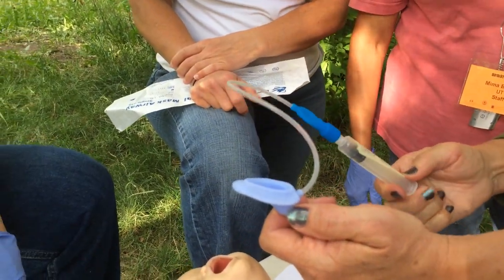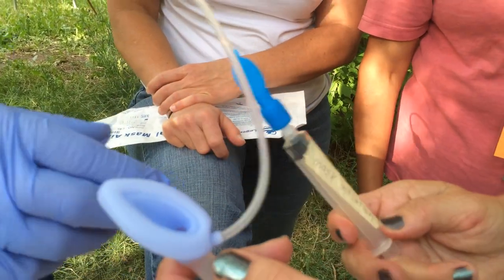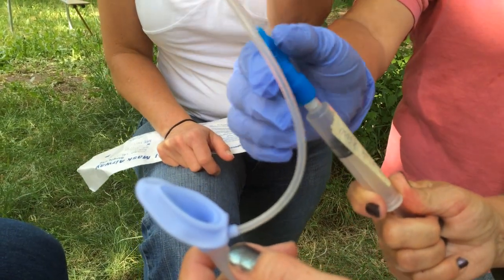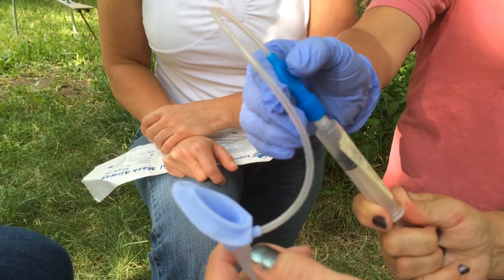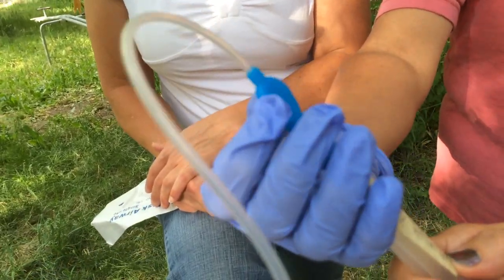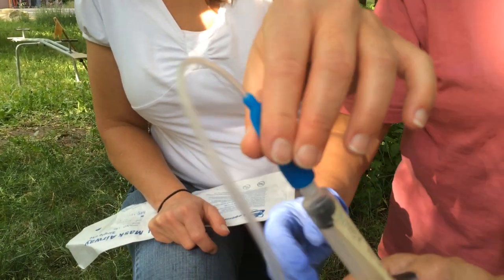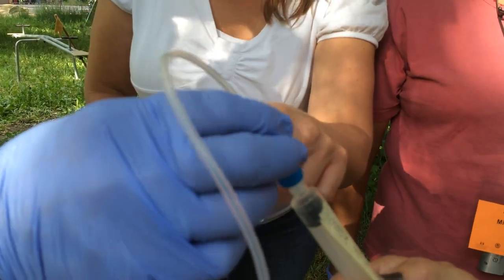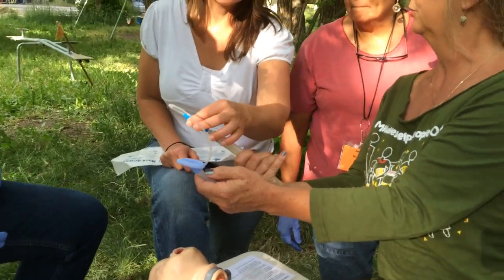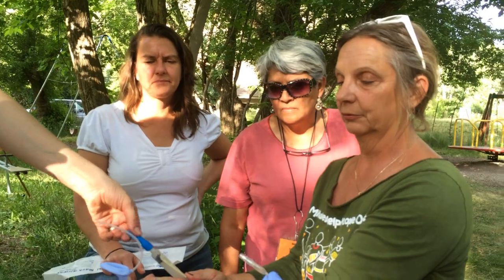Okay. See how that is? That's flat. And this is your gauge. So this is full. And now it's squishy. And this is flat. Feel it. Okay. And can you feel it now, at three quarters? It just feels, I call it smishy. It's not flat. That's not full. That's smishy. That's three quarters. Is this how we want it to feel? Yeah. Does this one feel squishy? Yep.